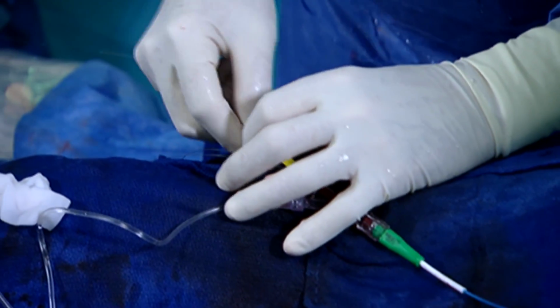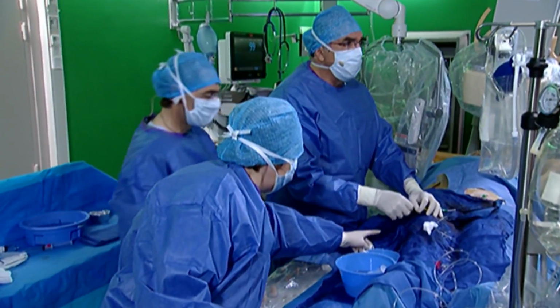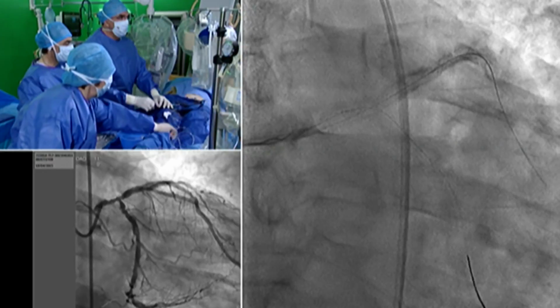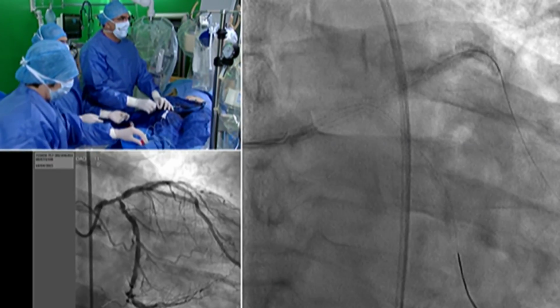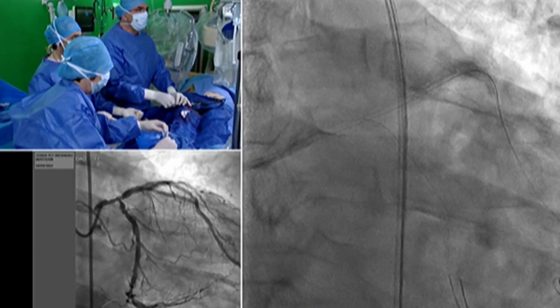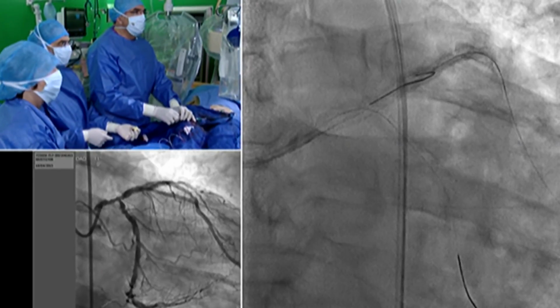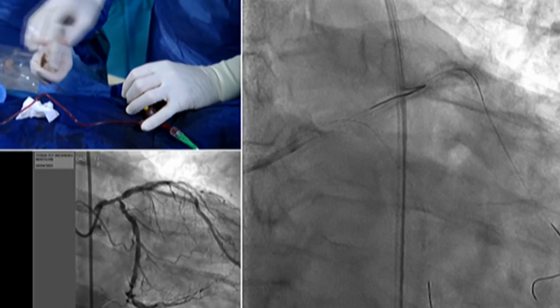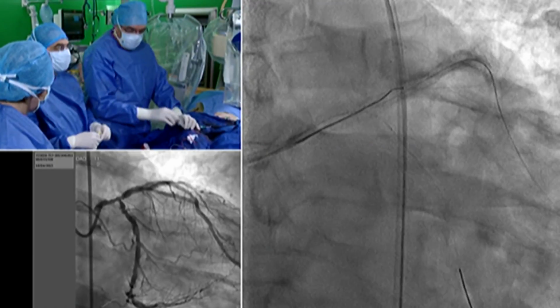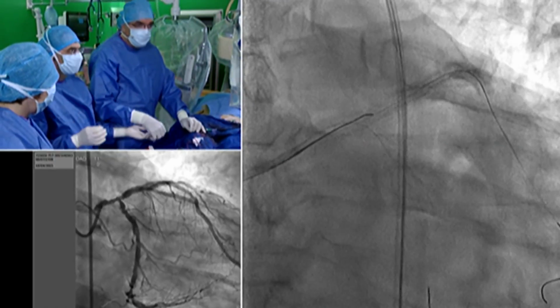So what we will do is to place the wire first in the proximal LAD, and to be sure that, as you see here, there is sometimes a problem when we have the jailed wire. So I have to modify the position of my guiding catheter and now try to go inside the LAD. So here now I am inside the LAD and I pull my wire close to the ostium of the circumflex.